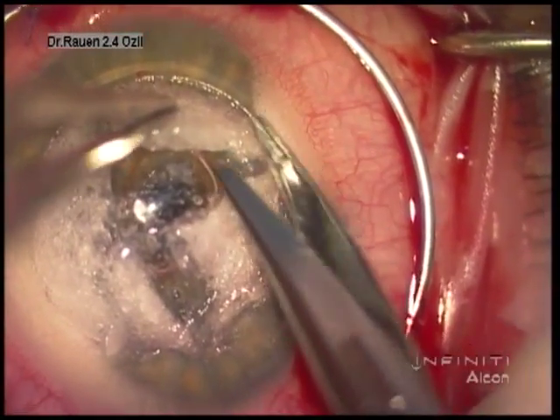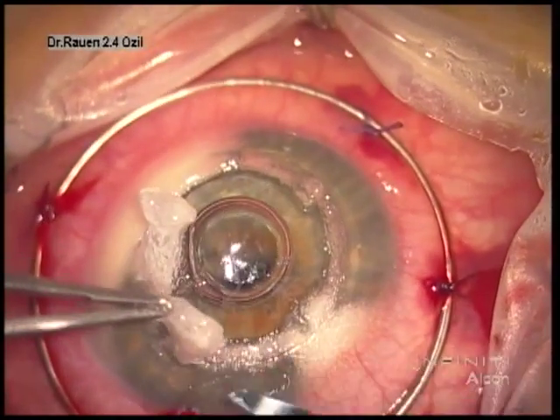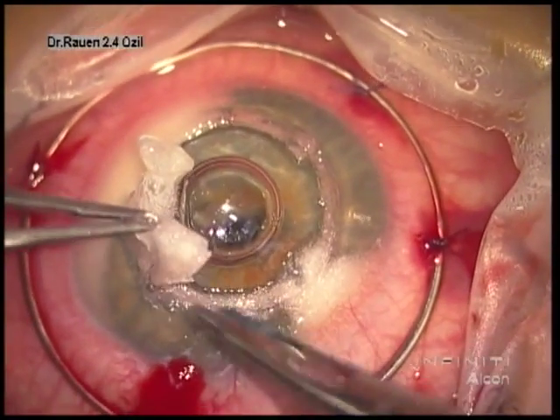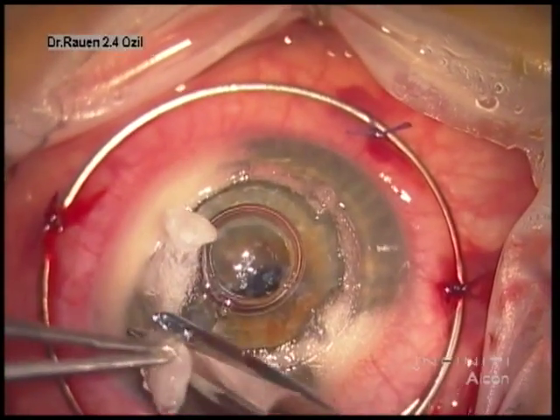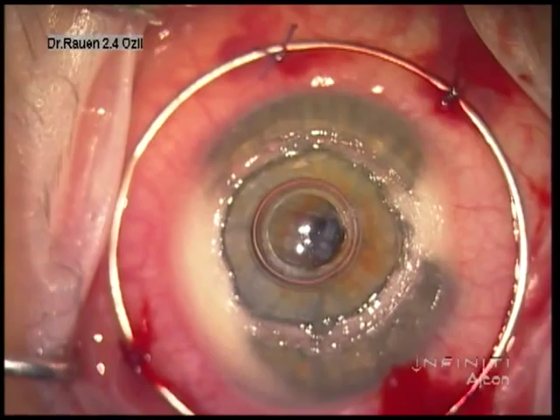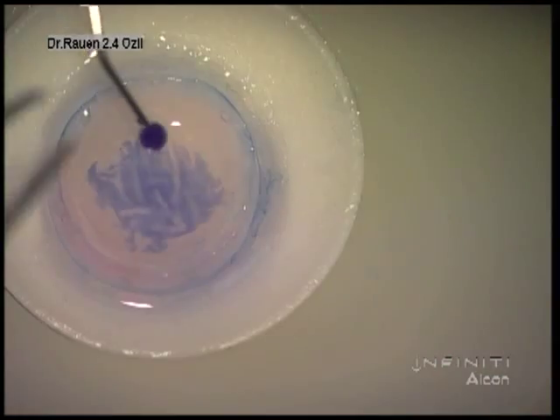These scissors are also specially designed for this type of surgery. You'll see the posterior aspect of them lacks any sharpness, and this also creates safety. Descemet's membrane that remains is quite thin and delicate, and we want to avoid any perforation at this point.